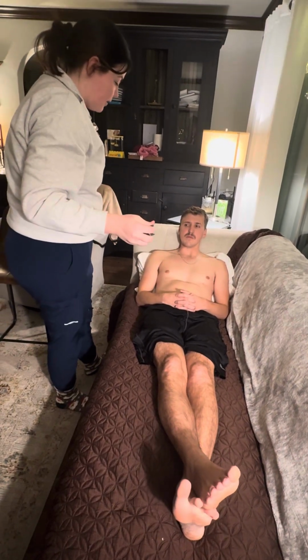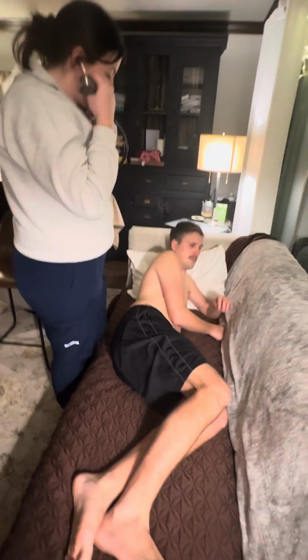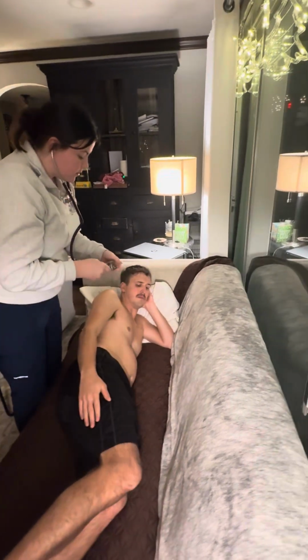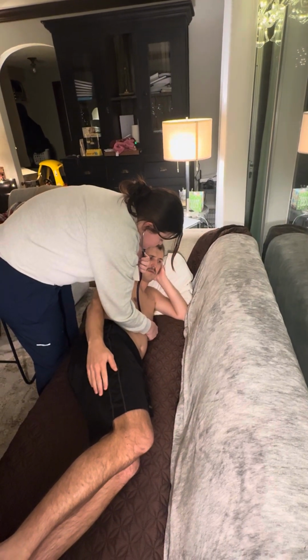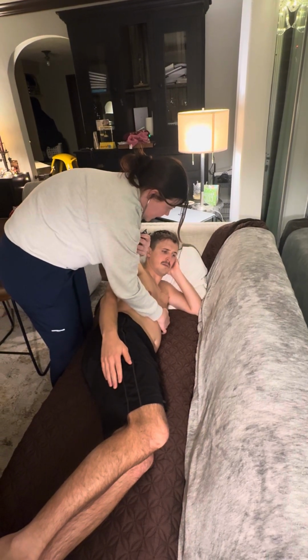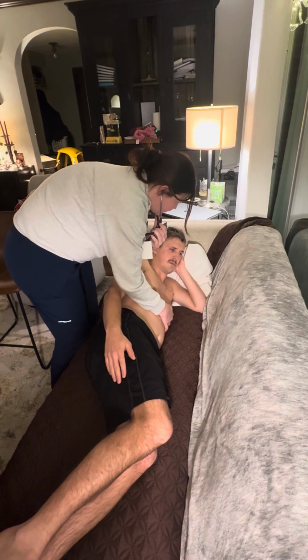Alrighty. Now I'm going to have you turn to the left. This is just another way for me to be able to hear any extra sounds. I'm going to listen at that mitral area below the nipple. No extra sounds heard, as well as I'm going to also feel again to feel a better pulsation, which I do feel better, at 2+.